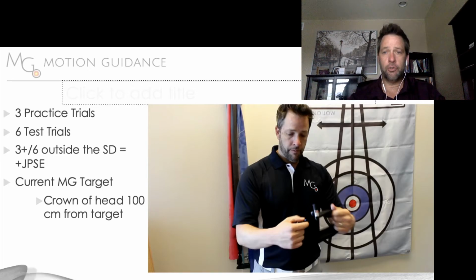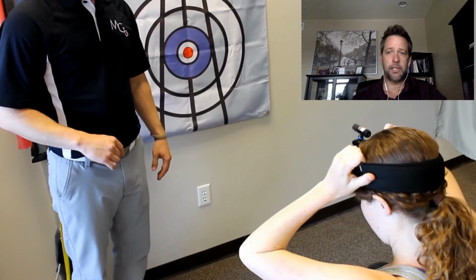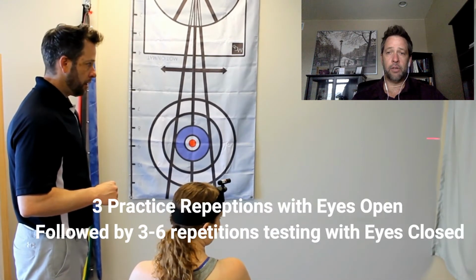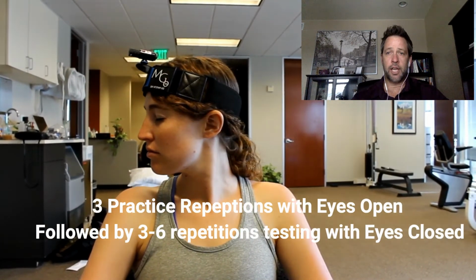Our target, if you look on the flag here, the deep blue, that's in all of our flags that we've ever created, so you'll be able to use that, and we go 100 centimeters from there, which is about 40 inches, where the patient, the crown of their head is placed, and you have them look right at the target. Then you adjust the laser to be inside the center of that target, and then they perform repetitions. So 3 practice repetitions, always coming back to the middle, always encouraging them to look as far as they can over their shoulder with each repetition, and then you do 6 repetitions with eyes closed.